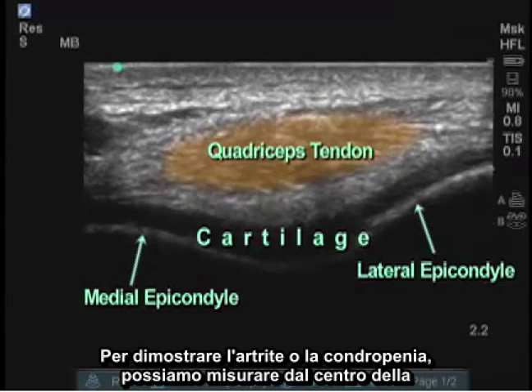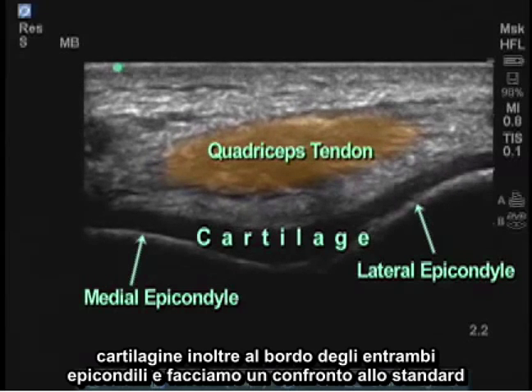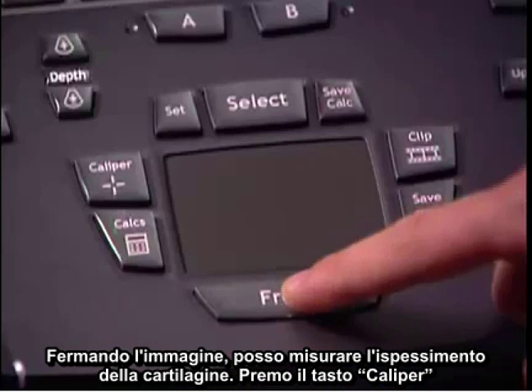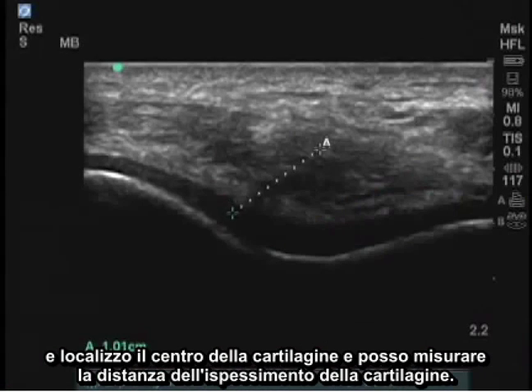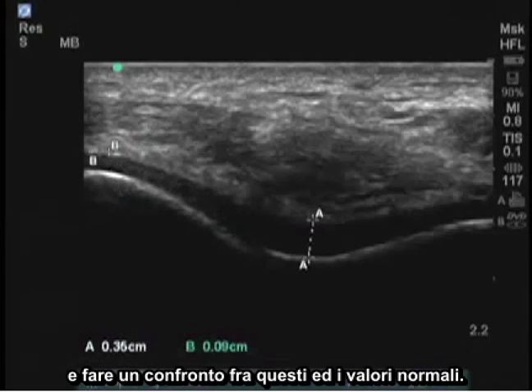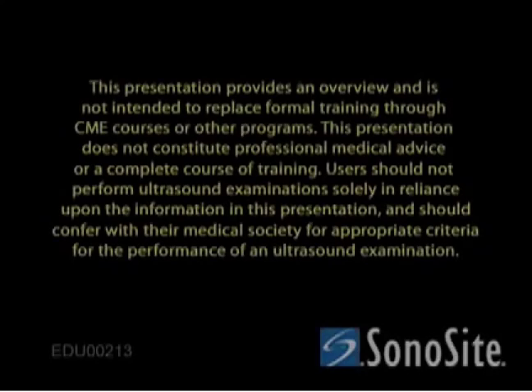In demonstration of arthritis or chondropenia, we can measure from the center of the cartilage as well as at the edge of each epicondyle and compare them to standards to determine the grade of osteoarthritis. By freezing the image, I can now measure the cartilage thickness. I press the caliper button, locate the center of the cartilage, and measure the distance of cartilage thickness. I can also measure the cartilage thickness at the point of each lateral condyle and compare these to normal values.